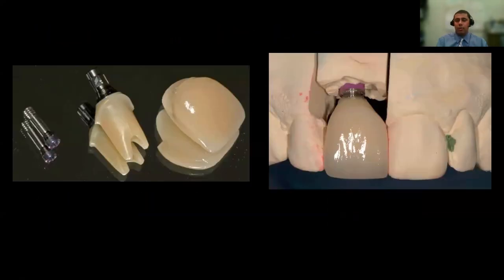And here is an example of that hybrid abutment. And while you would like to maintain titanium to titanium connection, there is some research that shows that with full contour zirconia restorations in lab studies over thousands of cycles of function, it resulted in wear inside the interface because you have a harder material, that's the zirconia, against a softer material, that's the titanium. So maintaining the same material contact may result in less wear. Is that supported by clinical trials and long-term studies? Absolutely not. However, we know that with ceramic abutments, zirconia abutments, there are more complications, things like abutment fracture, screw loosening.